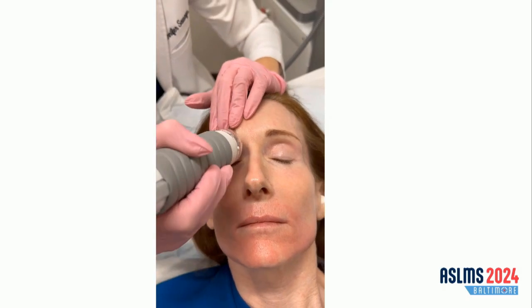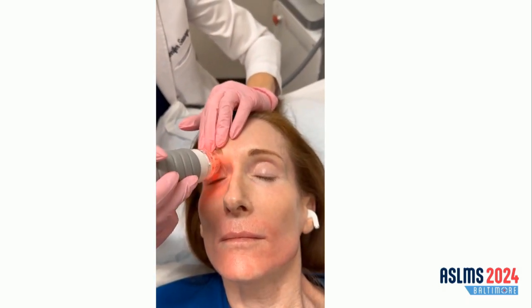These treatments are typically best for patients who have early changes. Perhaps they're trying to be preventative. We typically do this as a series of 3 to 4 treatment sessions performed monthly. It takes about 3 to 6 months to see the full amount of tissue tightening after they complete their series. But this is a good choice for patients who don't want or can't tolerate a lot of downtime, as they typically have 24 hours of erythema after.